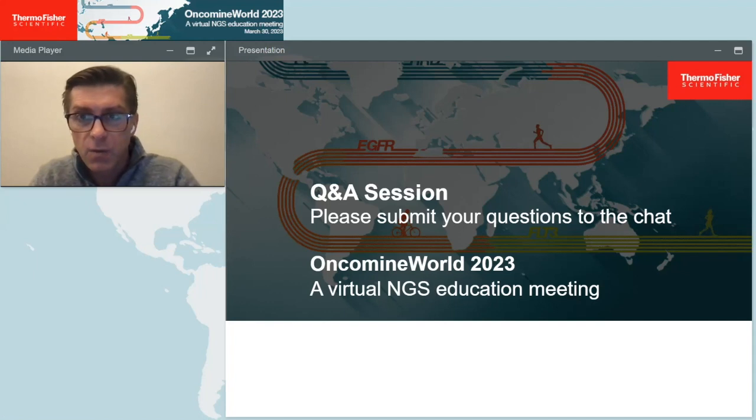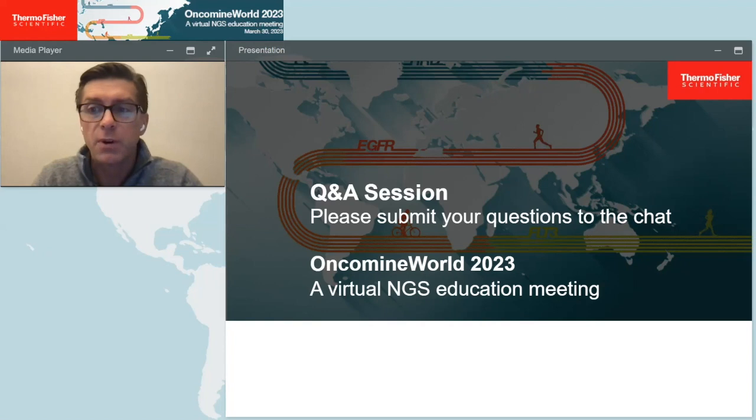Next question. What is the cost to sequence a whole human genome on the Genexus? We generally don't sequence whole human genomes on the Genexus. That's just not what it was built for. Many NGS instruments are developed for applications that require more sequence coverage but lower sequencing depth, like whole genome sequencing. On the other hand, the Genexus was designed for targeted NGS in clinical research, investigating smaller numbers of genes or genomic regions associated with various cancers or other diseases. In many cases, targeted NGS is the more economical, efficient, and effective approach, but in cases where whole genome sequencing is required, other instruments that have higher throughput and less automation would be appropriate.